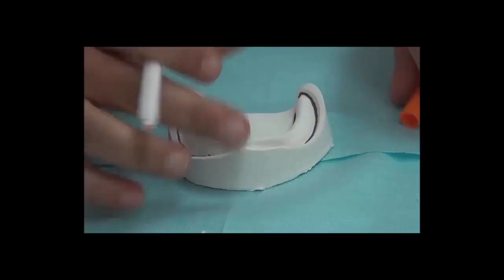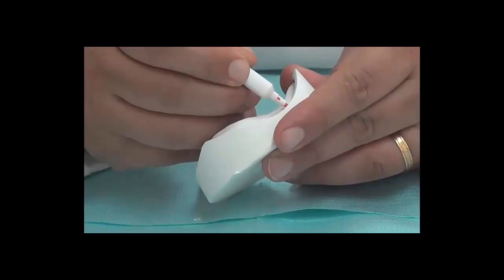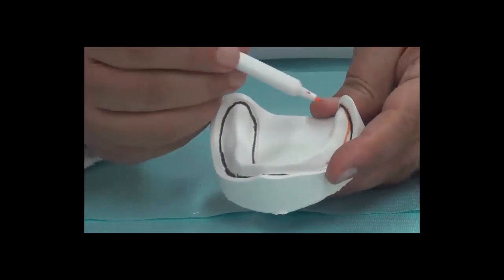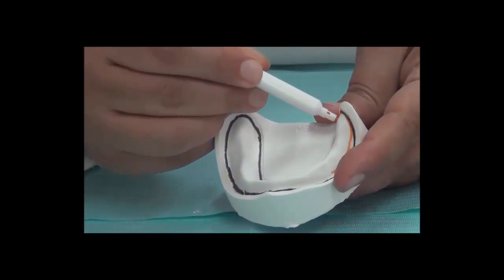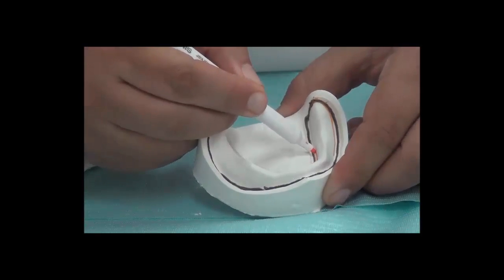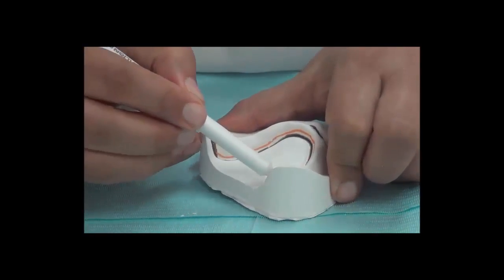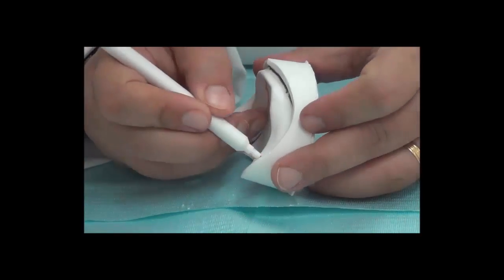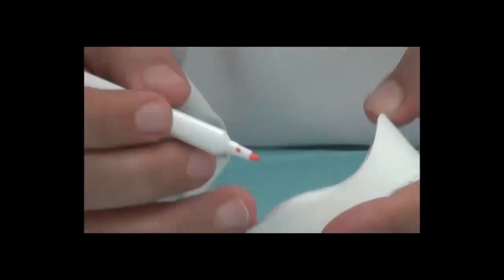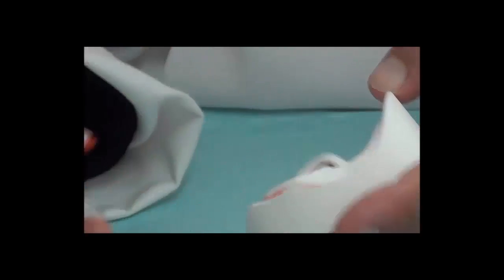The tray should be 2 millimeters short and away from the tissue. But once we reach the posterior edge, as we said, the two lines meet. So posteriorly, the two lines meet. Now I'm going to draw on the lingual the outline for the lower tray.